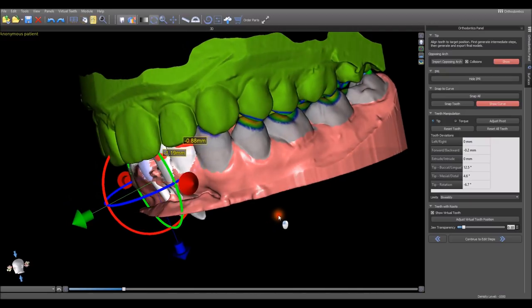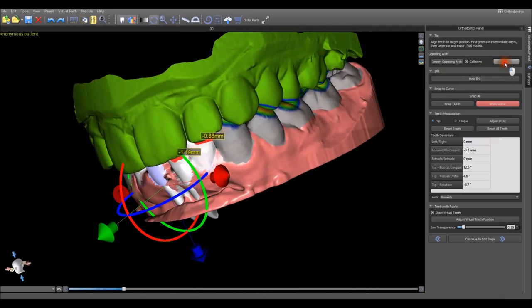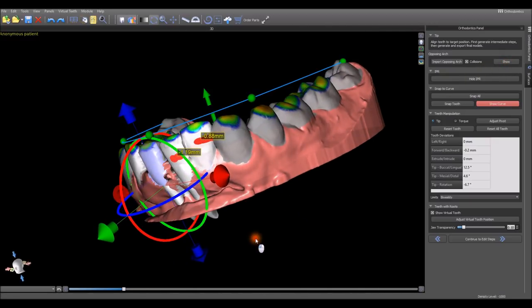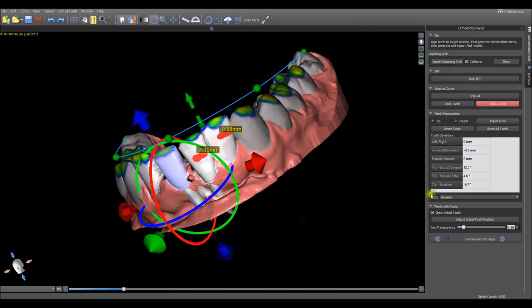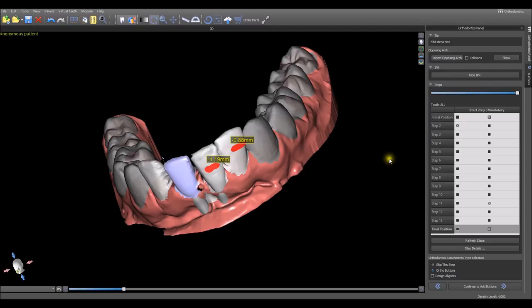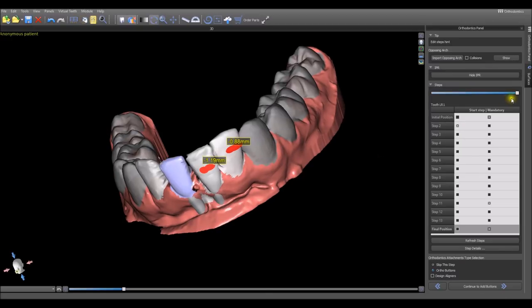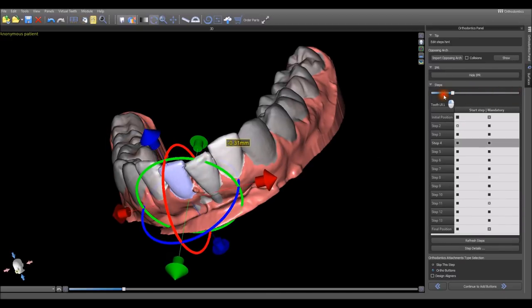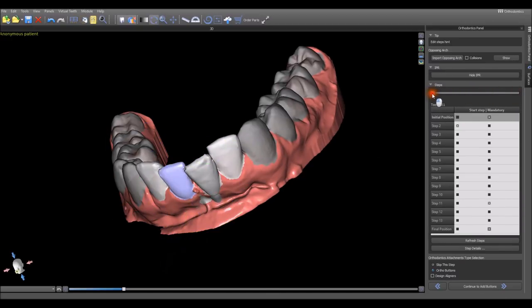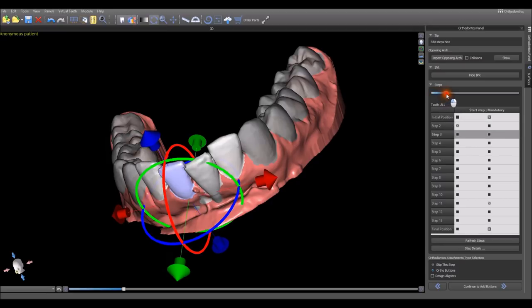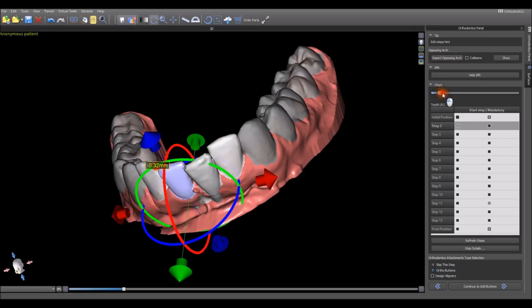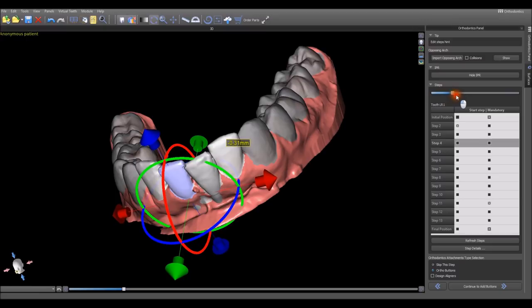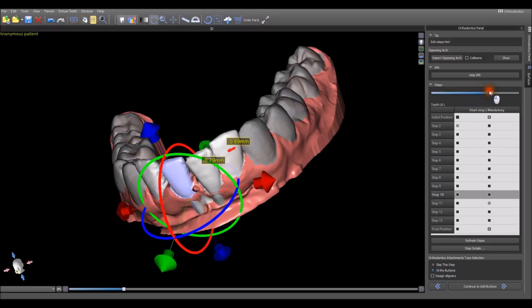Once we're happy with the tooth positioning, we click continue to edit steps. Here once again, we have the ability to show the opposing arch, to show or hide the IPR values. The slider here will show us the tooth movement as we progress through the relevant steps. Here's the initial positioning and now we're running through the relevant steps.